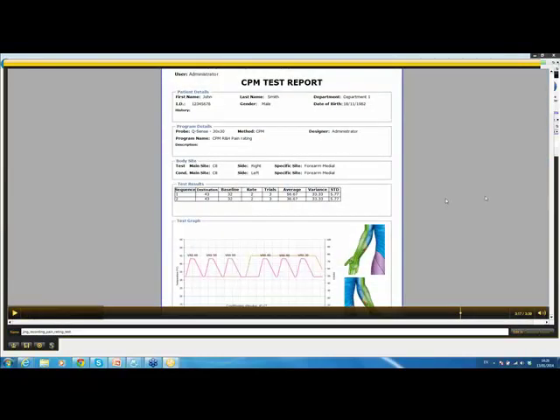Okay. So this is the report that was generated. Do you want to say something about this? This is the stimulus before the condition. The stimulus was applied, and this is the same stimulus after, parallel to the condition stimulus. As you can see, it was rated with approximately 20 units less. So this is what CPM is all about.